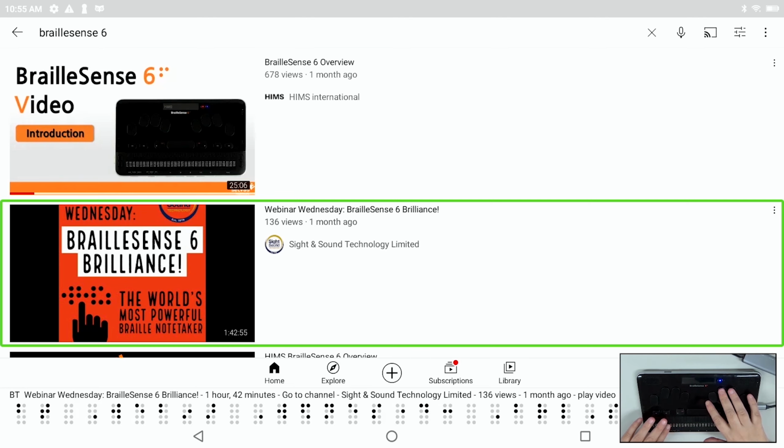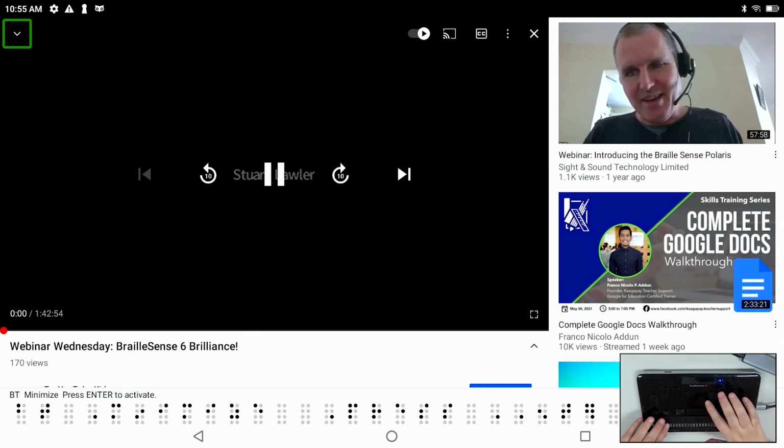So this is a webinar I actually did for Sight and Sound, so let's play that. Why not? List button minimize, press Enter to activate.